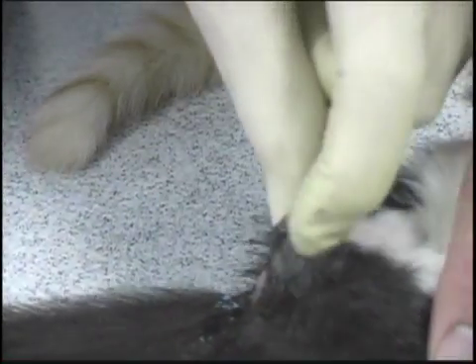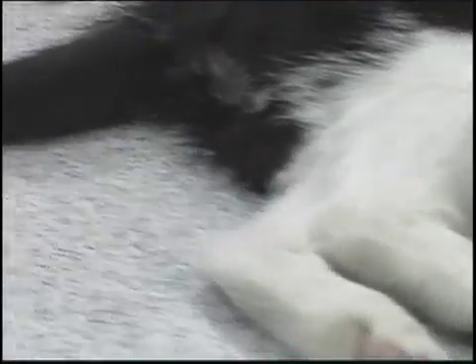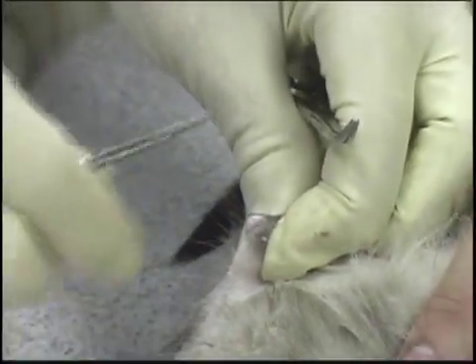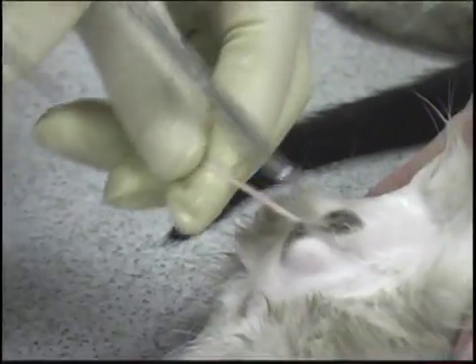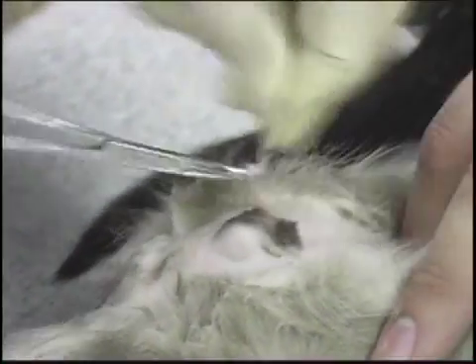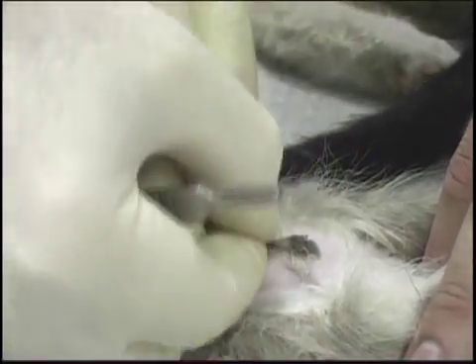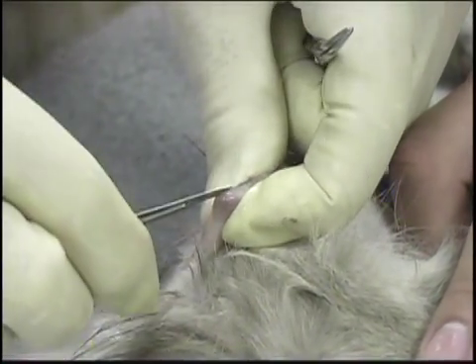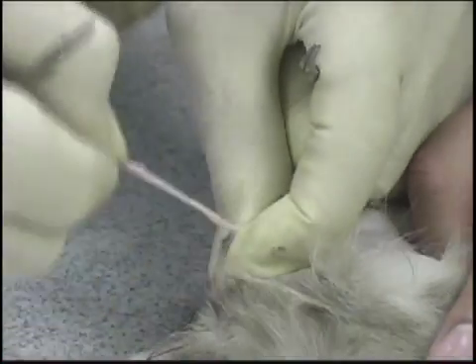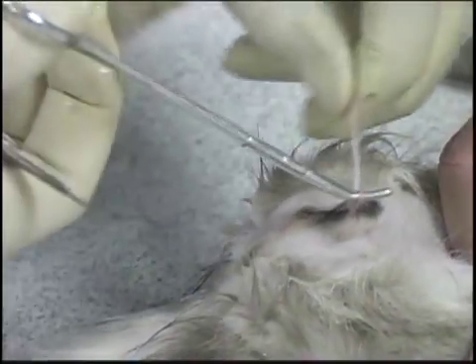This one is actually half and half. I'll go back and do the instrument tie again. What I am doing with this movement is cinching down on the knot to bring it good and tight.